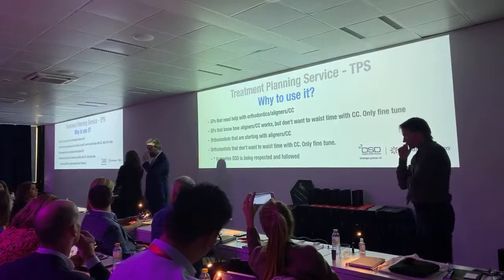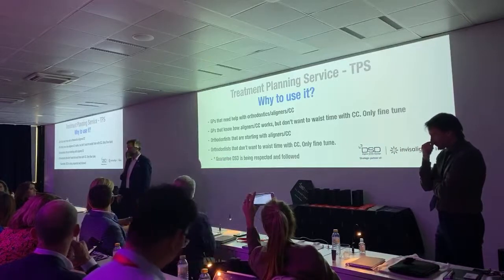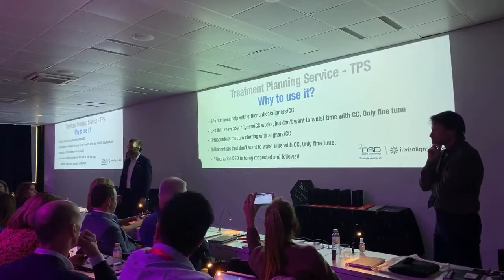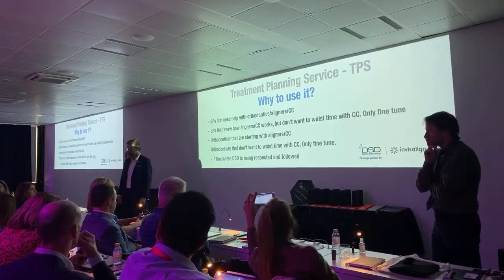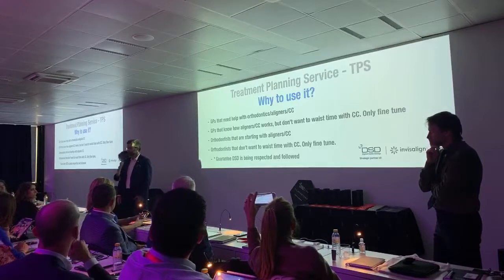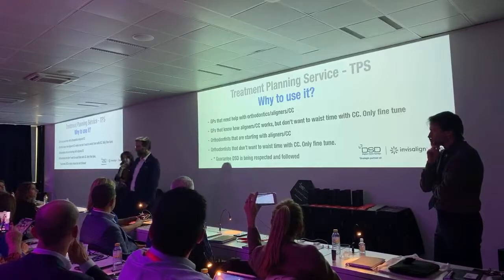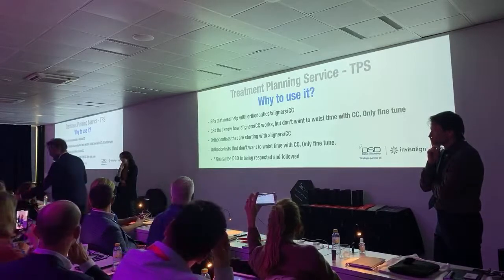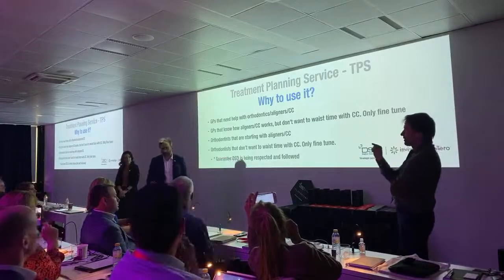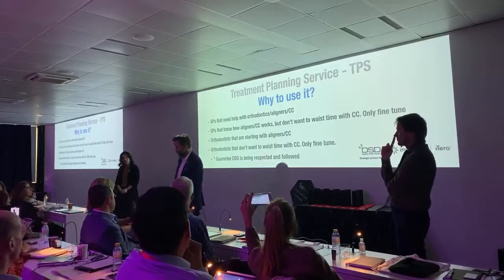If I'm the restorative dentist and I've had this situation with a planning center, I'm going to initiate the case, but then I'm going to transfer the case to the orthodontist. Is there a way to link that case with the orthodontist inside the DSD platform? Unfortunately, not yet. So you have to give him access to your account. That's the easiest way. So it's between you and him. The communication needs to go through you two, and he can have access if you allow him to go inside your account with us.